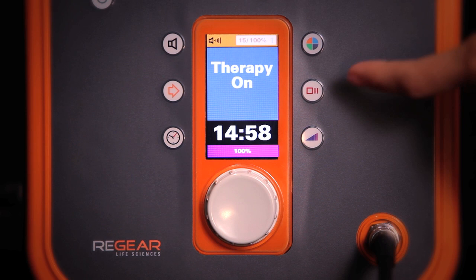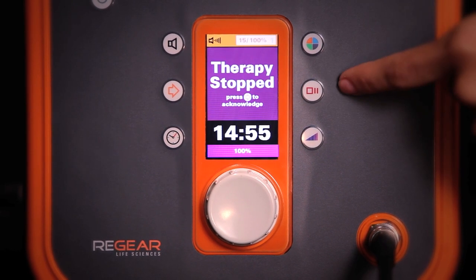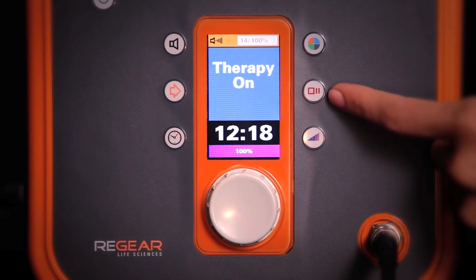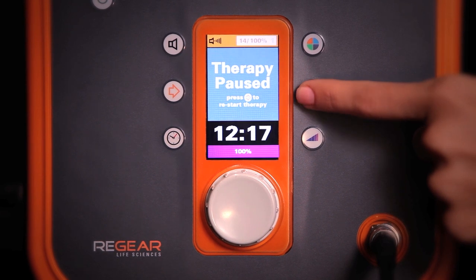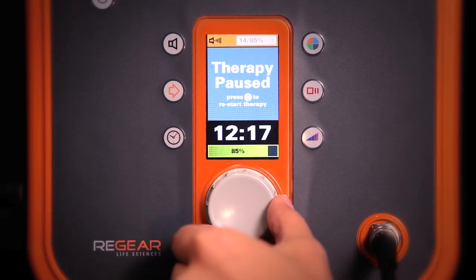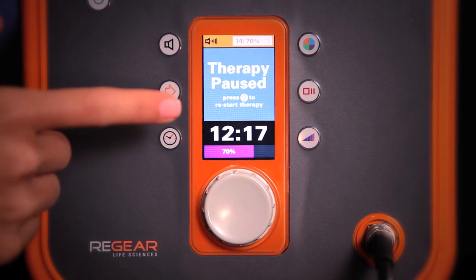Above intensity is the pause/stop button. Press once to pause a treatment; press twice to stop a treatment. You would pause a treatment if you need to increase or decrease the duration or intensity. To do this, press the button once, then press the intensity or therapy duration button, turn the gray knob to the desired setting, and hit the continue button to resume.